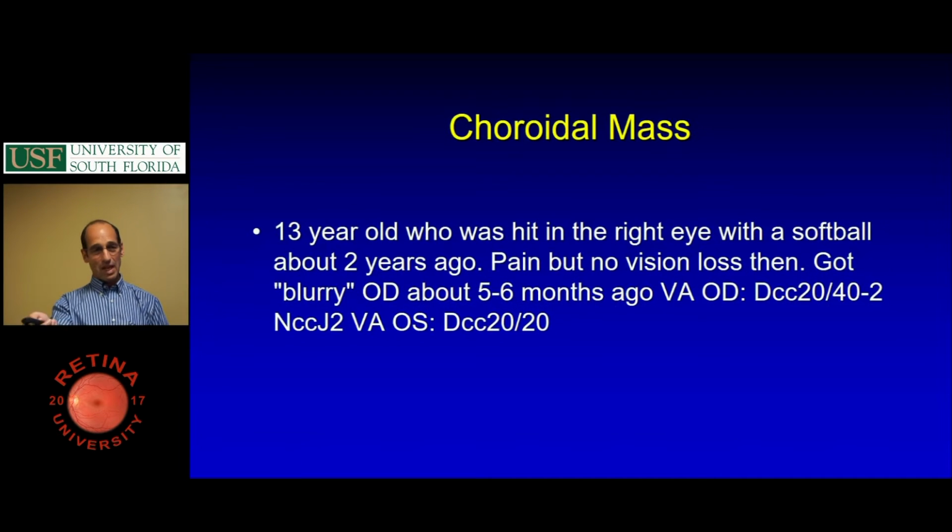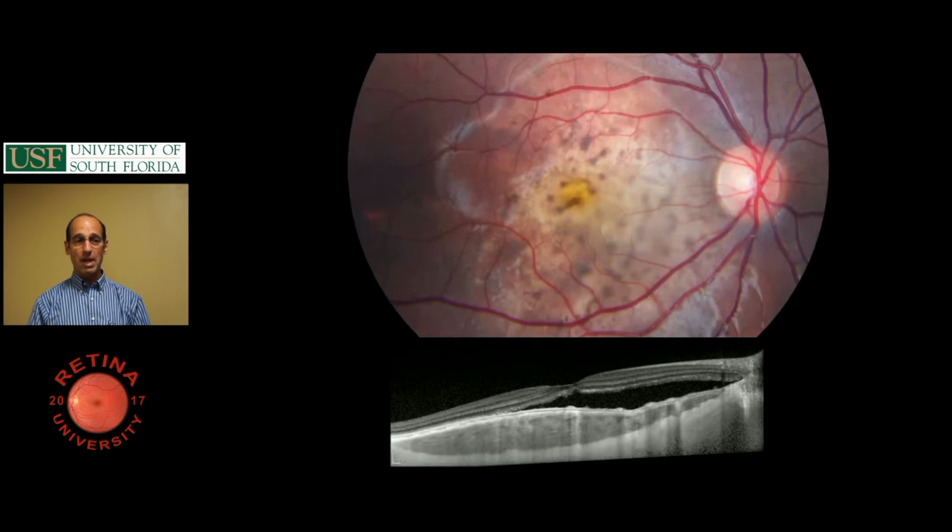But this is the case we showed last. This is Dr. Eichenbaum's case of a choroidal mass. This is the one we all had a million pictures of. I think I used your pictures because you have that fancy scanner. So this is the osteoma, probable osteoma. And there's the same sort of mass, but it must be compromised in the RPE and there's subretinal fluid.